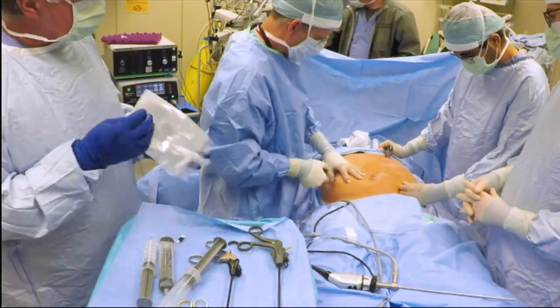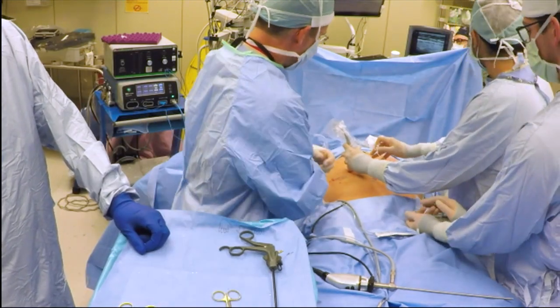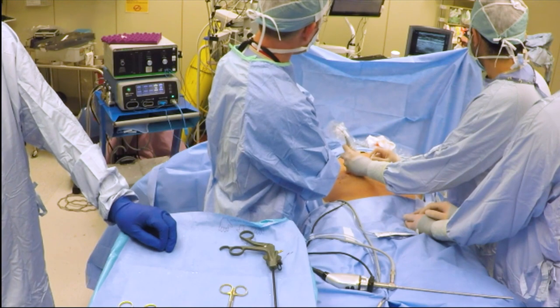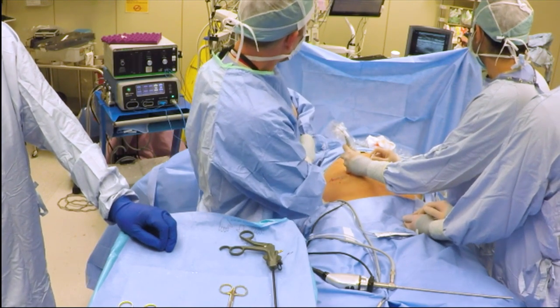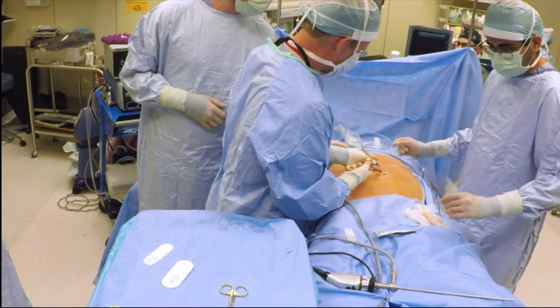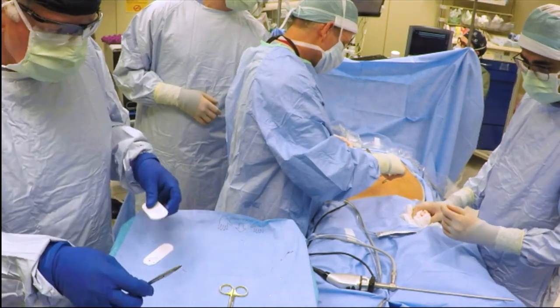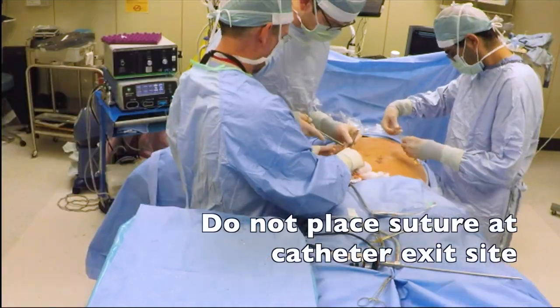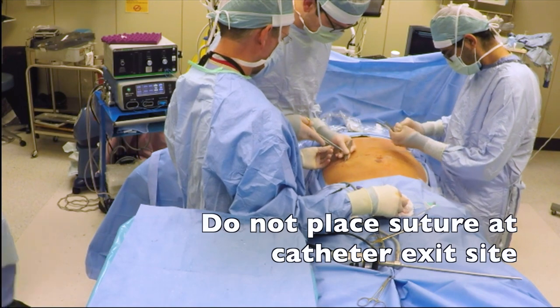Our practice is to perform an ultrasound-guided transversus abdominis plane block, or TAP block for short, for better pain control. Finally, our port sites and entrance incision are closed using suture, whereas our catheter exit site is not closed with suture to minimize the chance of infection, and instead covered with mupirocin and sterile dressing.